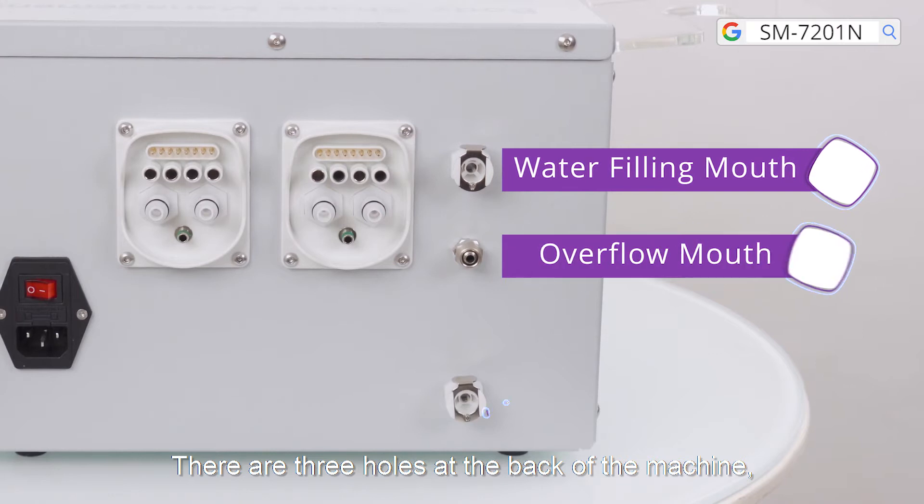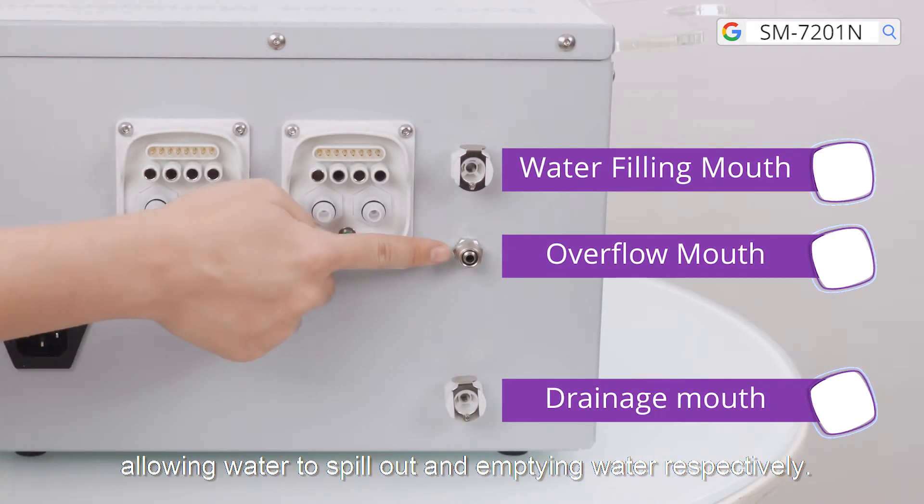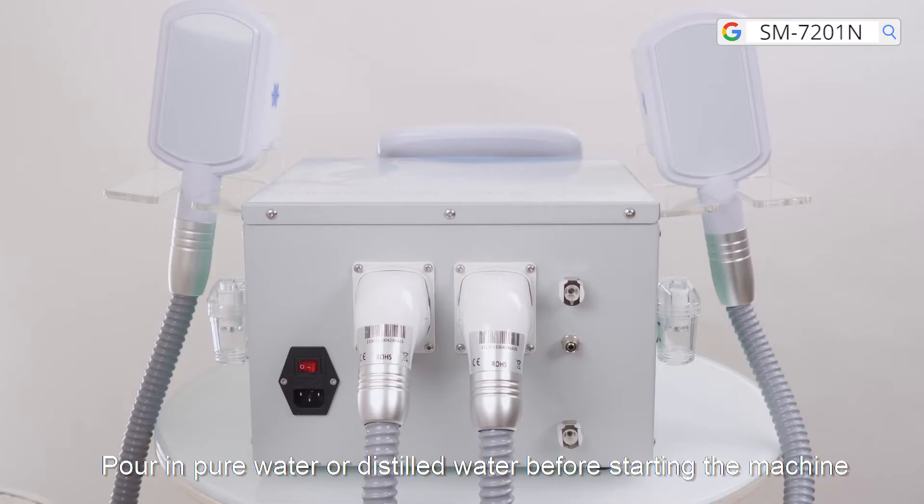There are three holes at the back of the machine which are used for pouring in water, allowing water to spill out, and emptying water respectively. Pour in pure water or distilled water before starting the machine.